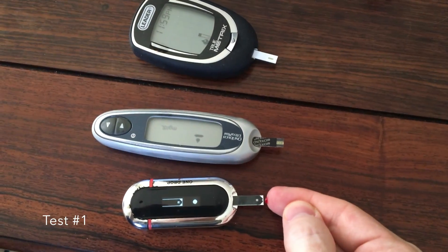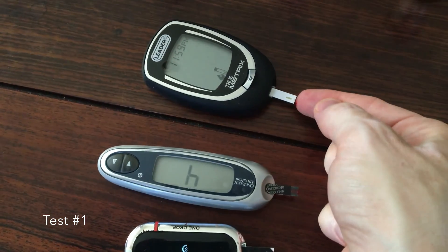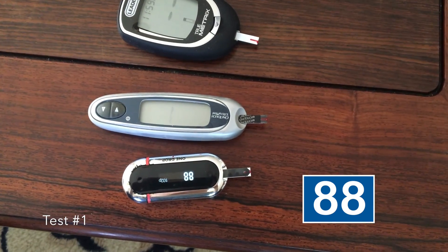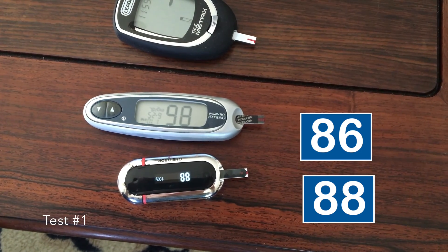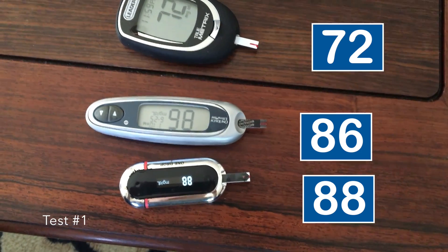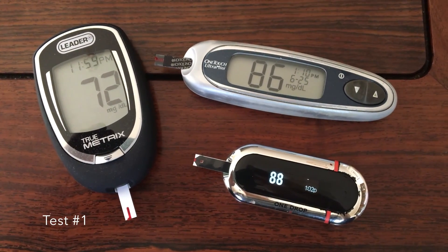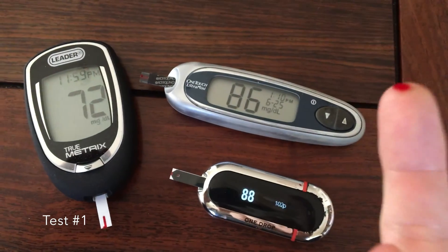Here's the first of three tests. I wish the OneDrop meter wouldn't beep like that. OneDrop: 88. OneTouch: 86. TrueMetrics: 72. So the Ones are almost identical, the TrueMetrics a little bit lower. I might eat something for a 72, but probably not for an 88.